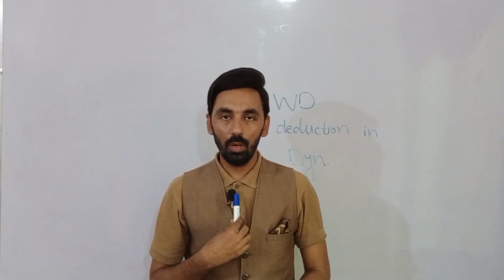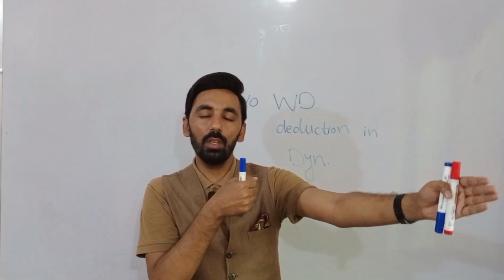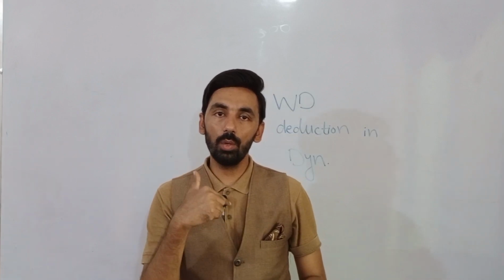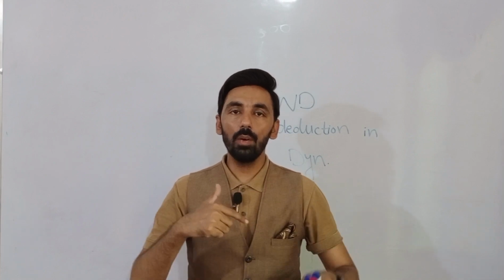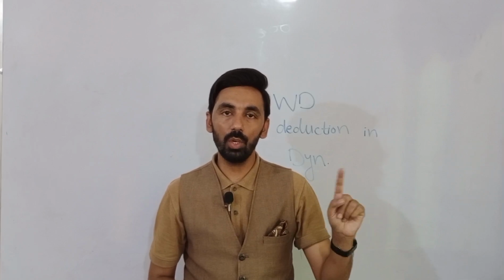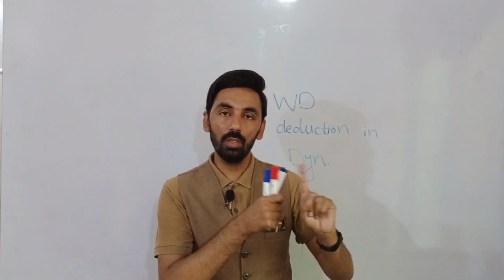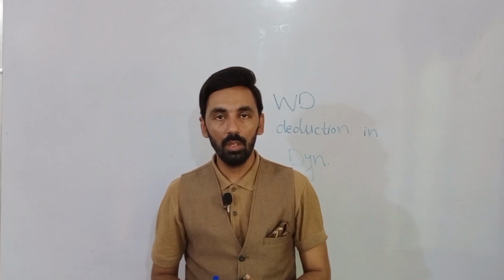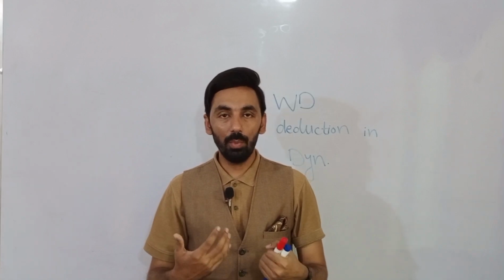I am the optometrist, the patient is before me, and I am going to perform dynamic retinoscopy on an adult. Then the working distance between the retinoscope and the patient should be 40 centimeters, or the working distance desired by the patient. If the patient wants to work at 40 centimeters, then the working distance between the patient and the retinoscope should be 40 centimeters. So that's why we are correcting the problem of accommodation at near.